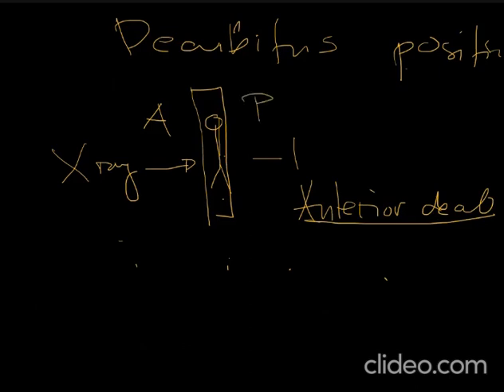That is anterior decubitus position. So the patient is lateral, and then the tube. So, anterior decube is the same as lateral position.